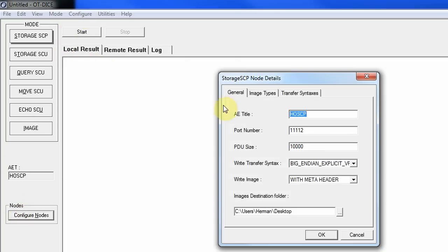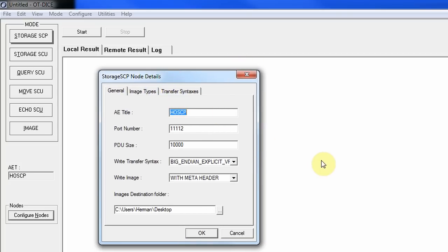Next we set up the SCP node details — this is for when the device is able to receive requests, images, or queries. We set the port to 11112, the well-known recommended port number. The PDU size is set to 10,000. I'd recommend checking the PDU range in the conformance statement and starting in the middle, then testing the lowest and highest if there are any performance concerns.